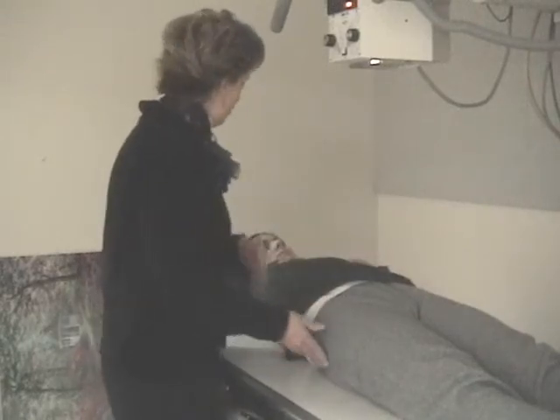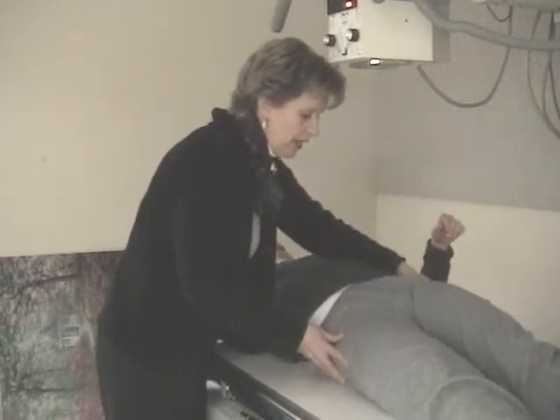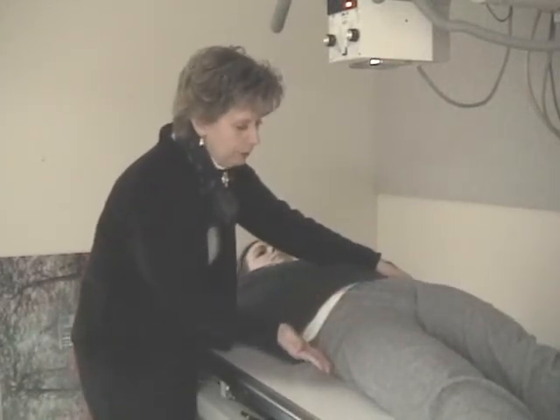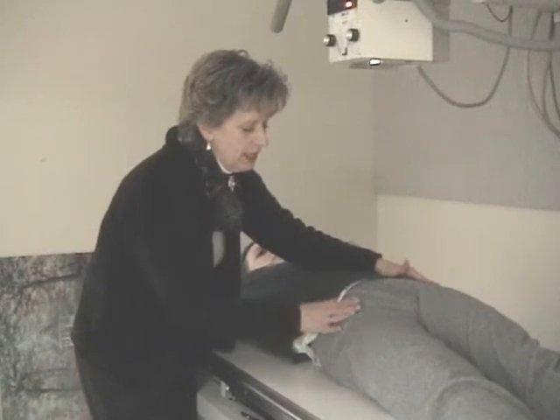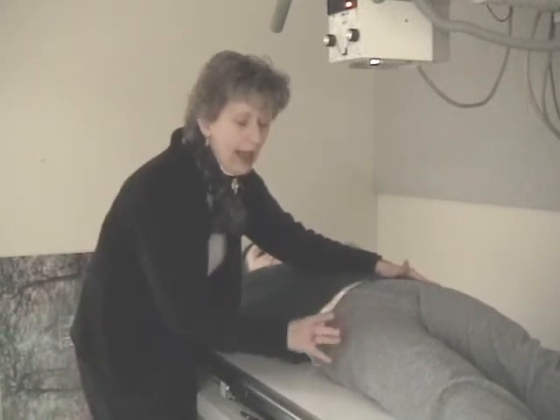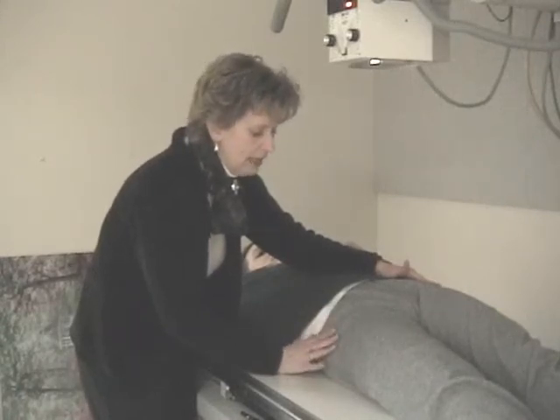If there's rotation, let's kind of mock that, Jacqueline. Slight rotation. What that does is this wing of the ilium becomes wider. This one becomes more narrow. And what happens to the obturator foramen is when the wing becomes wider, the right obturator foramen actually becomes smaller. Let me say that again.